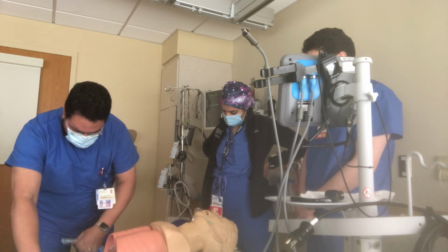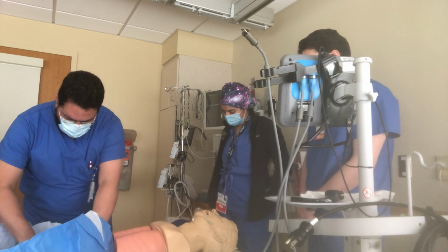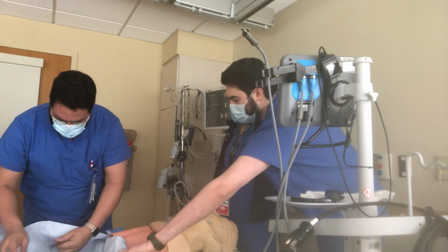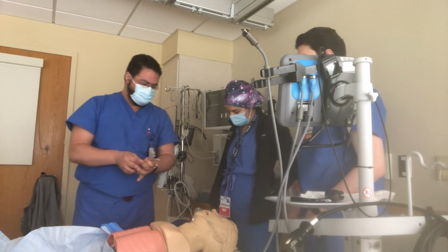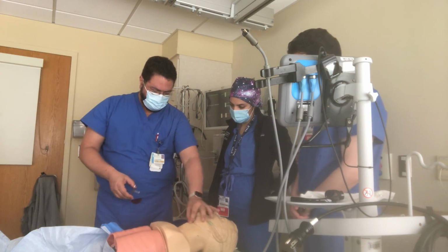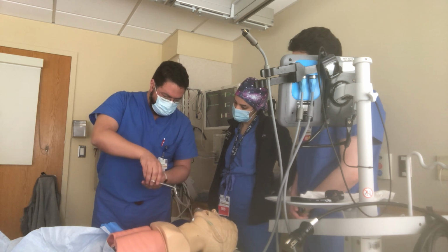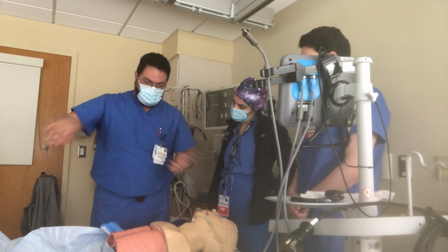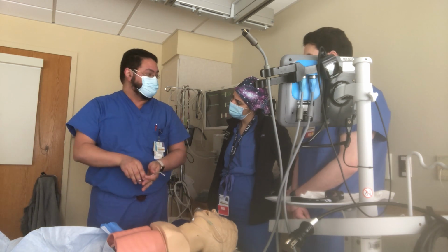So very medieval way of doing this, and it's really suitable for the OR, if you really want to do it. So this is the tracheal ring crusher. After you cut vertical and then horizontal, you put this one inside, and when you push like this, it crushes the thyroid and the cricoid and everything, makes a big blast hole inside.